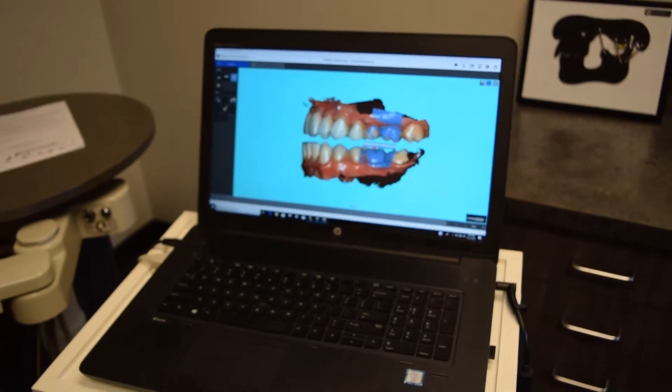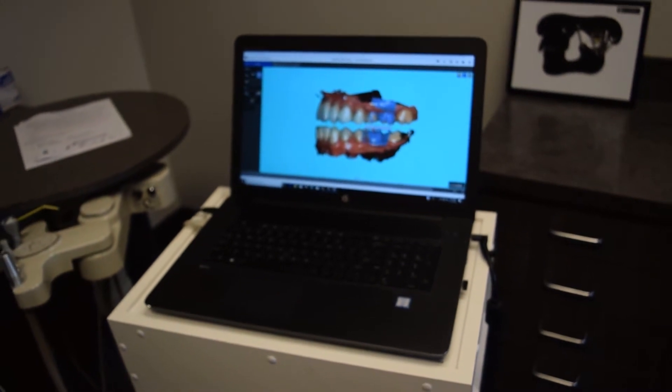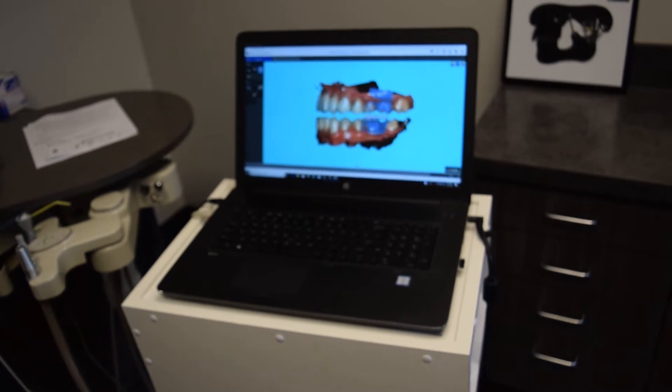If you're doing scans, you would email this to the dental laboratory. If you're doing a full bite, the only thing you would do is fill in the first molars and premolars as well.